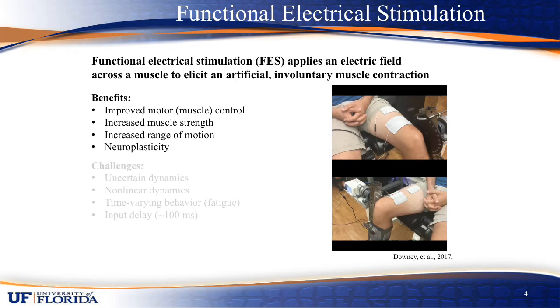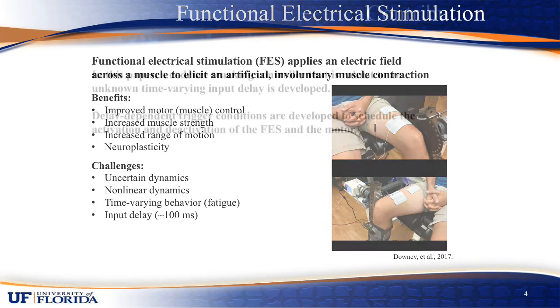However, there are numerous challenges. For example, there are uncertain and nonlinear dynamics and time-varying behavior as a result of fatigue. There also is an input delay. This input delay can potentially destabilize the control system and must be considered. The input delay causes further complications for a switched system that switches between motor and FES control. For example, the delay must be considered to properly schedule when to apply the stimulation so that muscle contractions do not occur in antagonistic muscles.